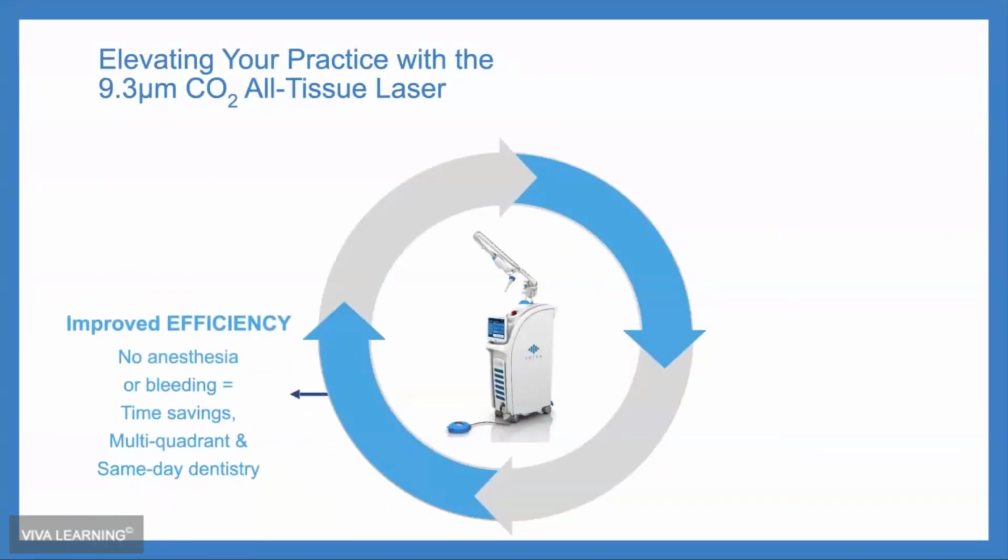So a few key points that I would like to talk on, because again, I learned this myself over the last 7 years. A lot of us always assume we're being as efficient as possible. I don't think anybody's trying to waste anybody's time when we're at work. But one thing I noticed was my efficiency went up dramatically when I cut out the anesthesia part for the majority of these procedures you're going to see today. And also when the bleeding is no longer causing me to leave the room because I can't really work in a bloody field. So I was leaving the room and having my dental assistant manage it, and that was really bloating the appointment. The patient really didn't need to be there that long if you could control bleeding.